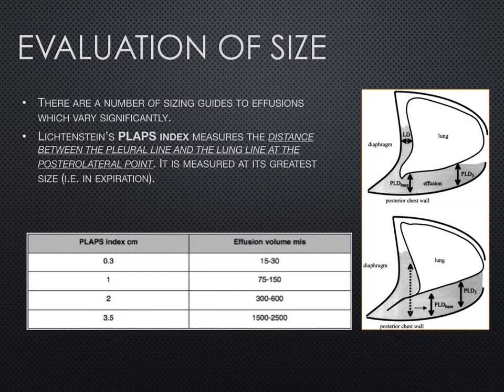You can do this in real time, or you can just utilize a frozen image where you're seeing the largest available space for you to measure. And Lichtenstein gives a guide that if you can measure in centimeters, you can equate that to a volume in mils.